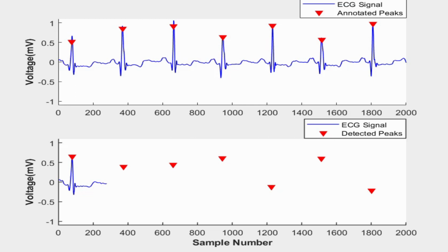To enhance our peaks, FRFT is applied to the noise and baseline drift-free ECG signal, which rotates it in the time-frequency plane. After enhancement, 2 event and cycle-based moving averages are calculated, which help in the generation of blocks of interest. These blocks are distinguished from the desired blocks by applying different thresholds. In each block, the maximum value in the corresponding enhanced signal is referred to as a peak.